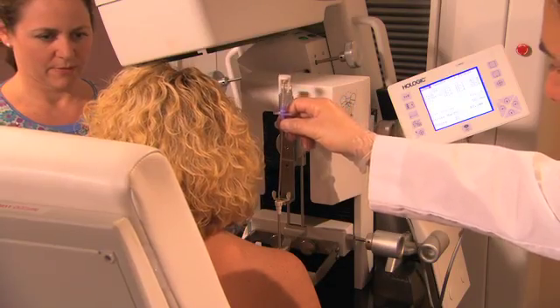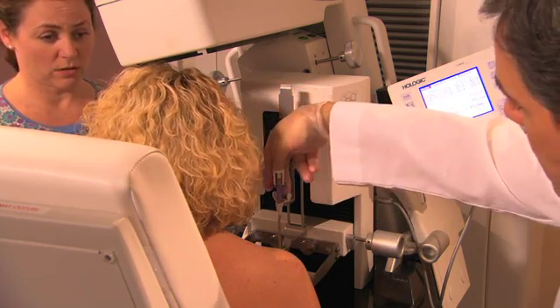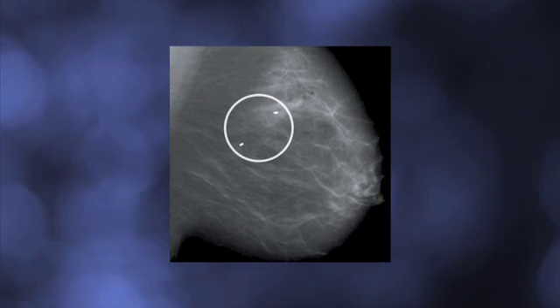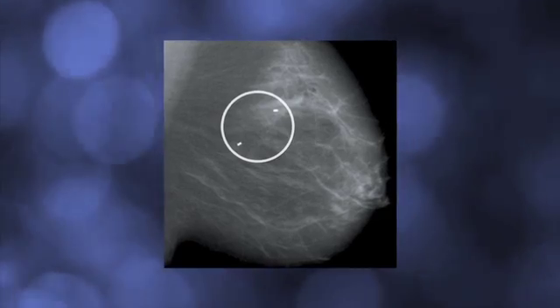Finally, a tiny marker is placed at the spot where they took the sample. This can be seen in future mammograms to show the location of this biopsy, and to minimize the chance that this location would be biopsied again. They check one more set of images to make sure the marker has been placed successfully.